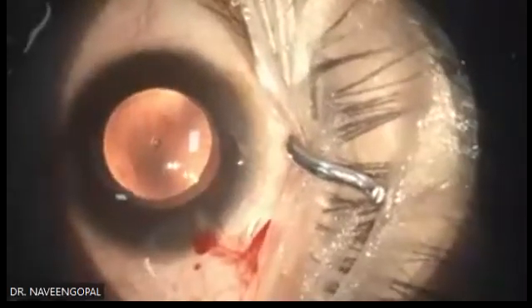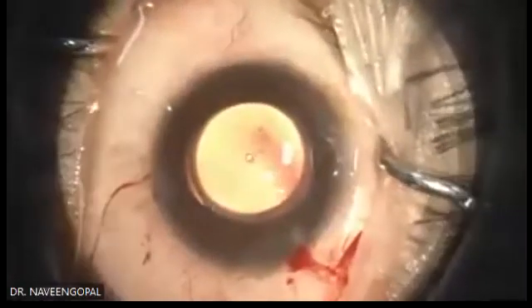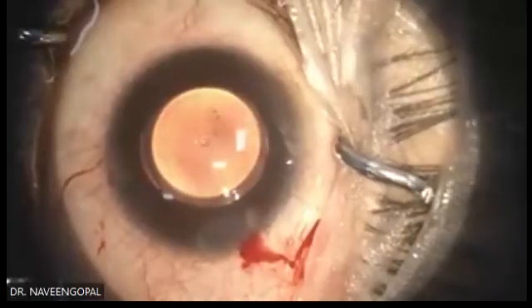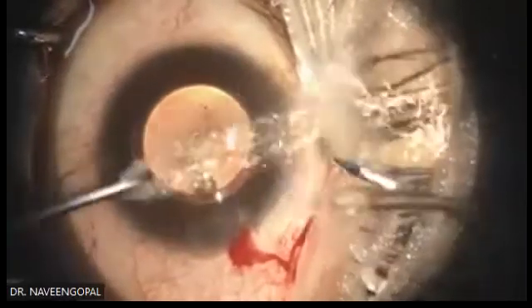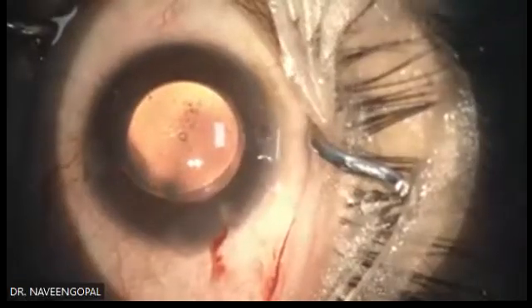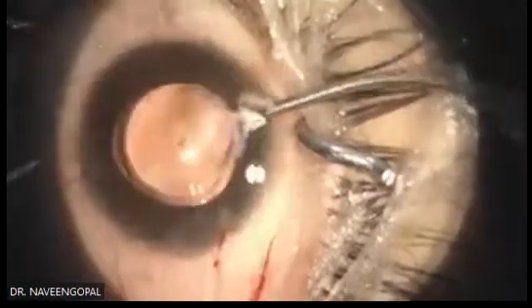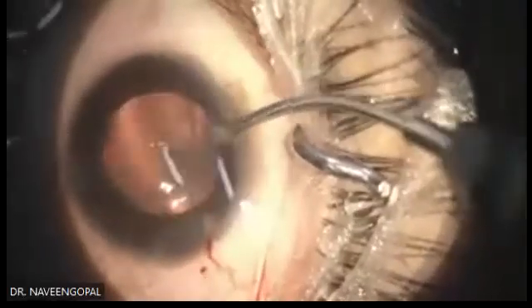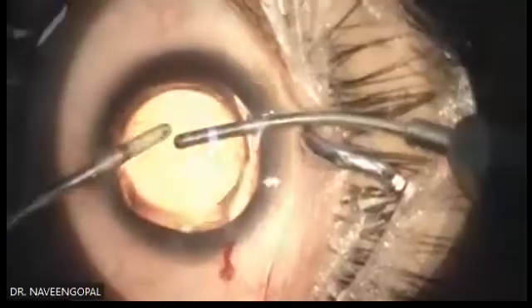Now tucking is over. Now the next step is very important. You have to take out the visco, whatever you have put, or else next day you will have very high pressure. You at least take 5 minutes to do this. Bottle height is 90. I do this for 5 minutes.